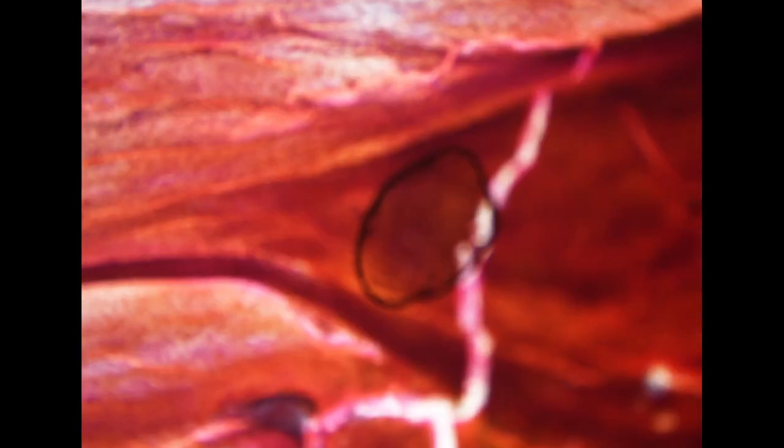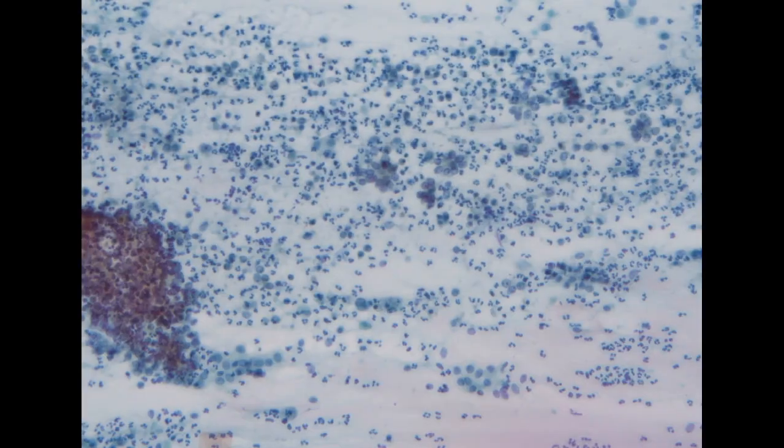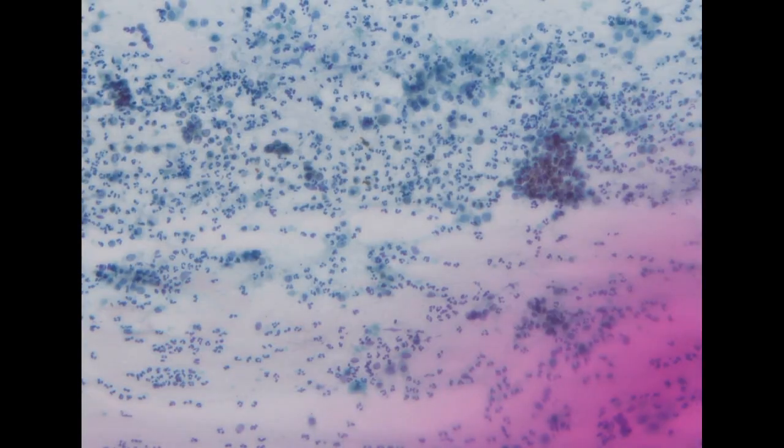So we call the pap smear atrophy, and we address the presence of endometrial debris. And this is enough for the clinician because they already know the patient presented with vaginal bleeding. So the next thing they need to do is to check firstly by sono to see the endometrial condition, and maybe follow with D&C.